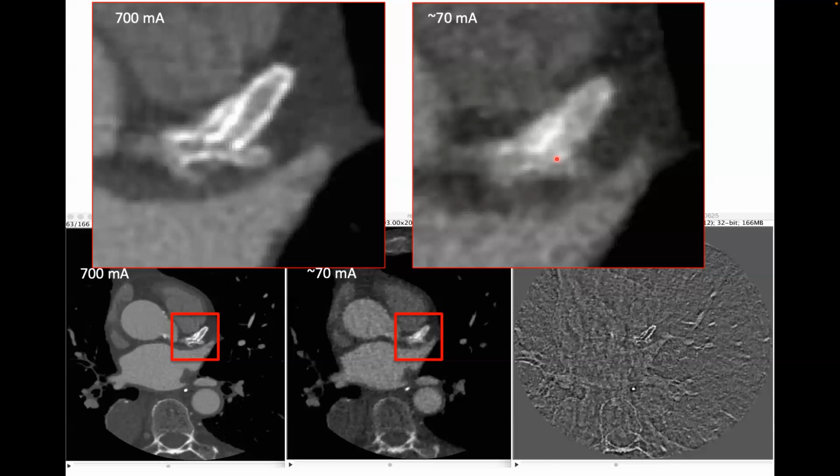One thing you can do is put a person standing somewhere. Oh, like those carnival rides where you stand up against the wall? Well, not that. You just put a person on a platform that spins. If you put an X-ray source right next to them and shine a shadow on a wall that's, say, 3 or 4 meters away, now that picture of them on the wall is quite large, right? So you get a high resolution picture, and then you rotate the person. So that's another way of doing it.